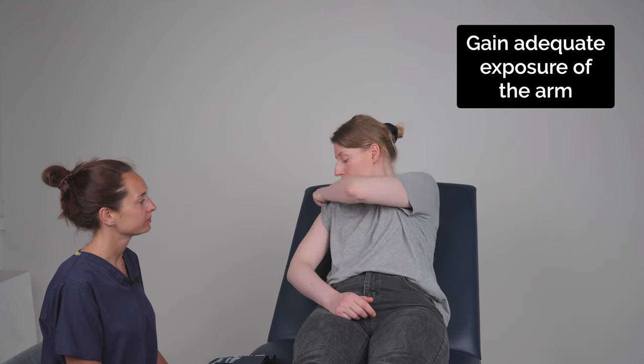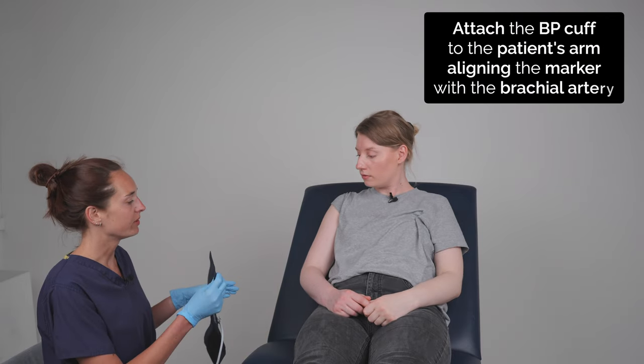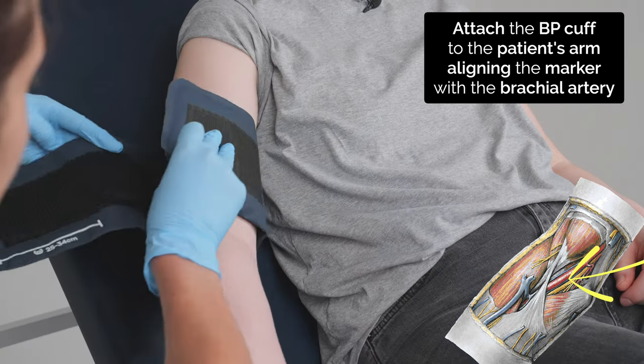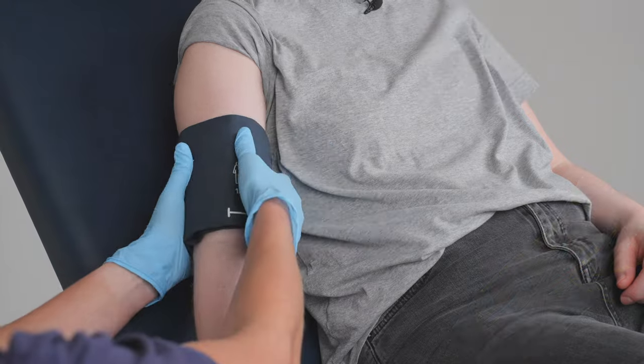Before we start could I ask you to roll your sleeve up please? Yes. And now I'll place this on your arm. Can you just pop your arm by your side for me? That's perfect, thank you.